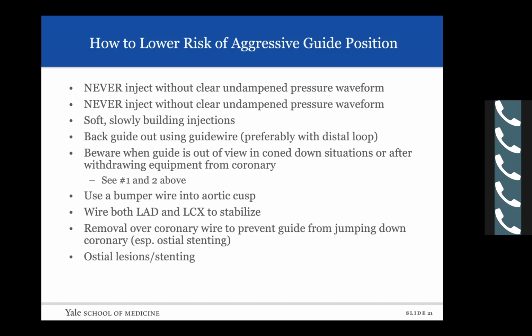The other thing you have to be careful of is you get focused on the lesion that you're working on, you're pulling balloons back and you're not remembering what the guide position is like. I look at the larger frame sizes so I can see the wire tip in the guide when we're working, to make sure that the guide's not being drawn down into the coronary artery.